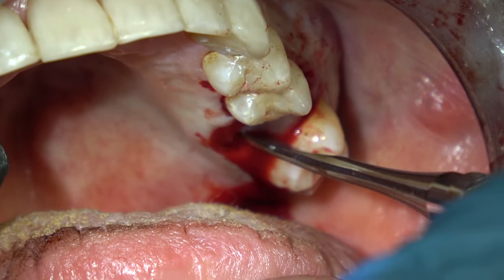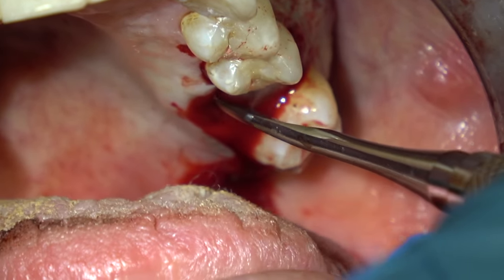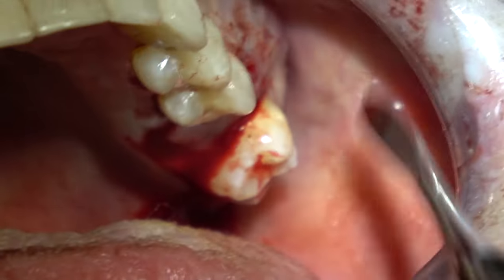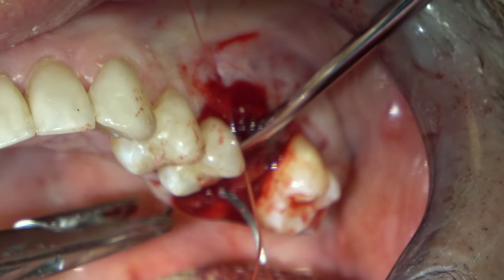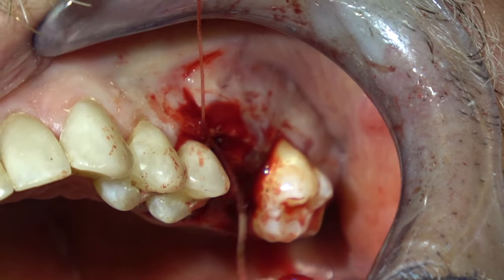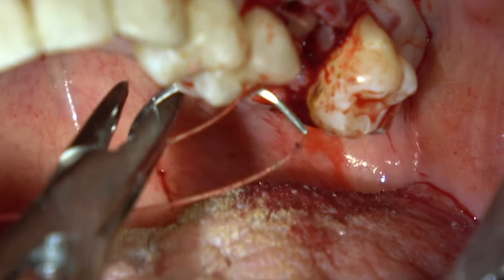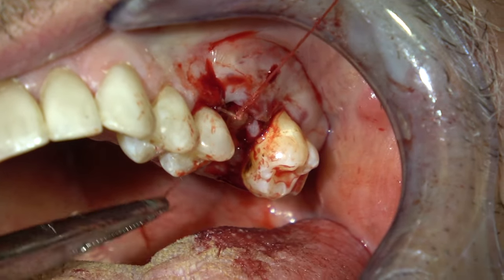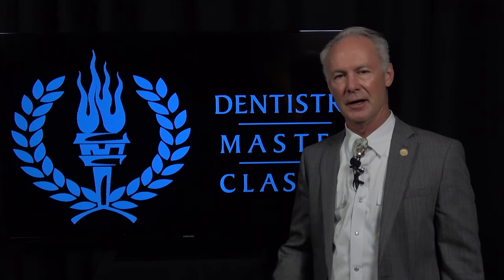I want a collagen membrane that doesn't have memory — once it gets wet, I want it to adapt to whatever you place it over, not stiffen like a starch shirt. This Contour Adapt works very well for that. Here it is in place tucked in. Then I'm using 4-0 gut suture — you can use 3-0 or 4-0 to secure the flaps. You don't have to have primary closure. Just a snug adaptation, don't pull it real tight or the suture will pull out, and don't want blanching. And that's the Dental Minute — these techniques work, and they work every time.